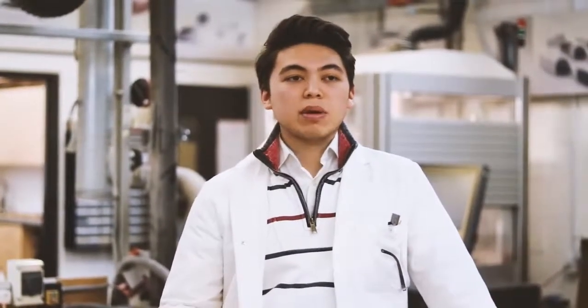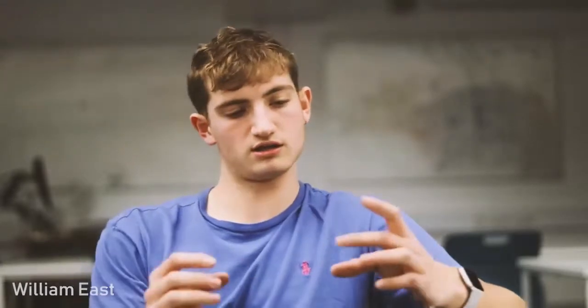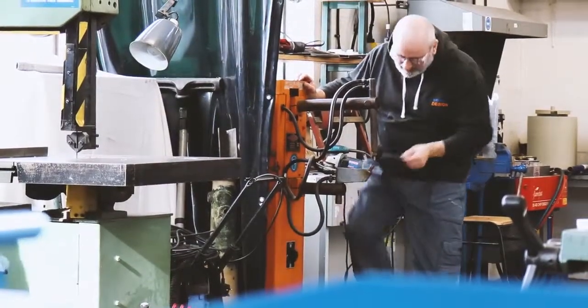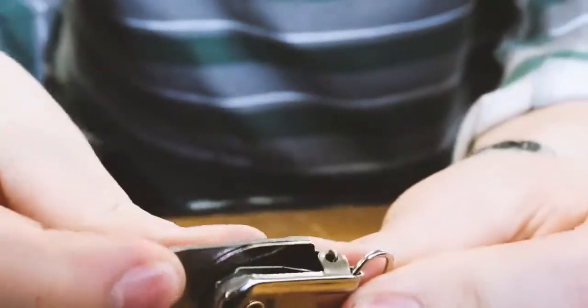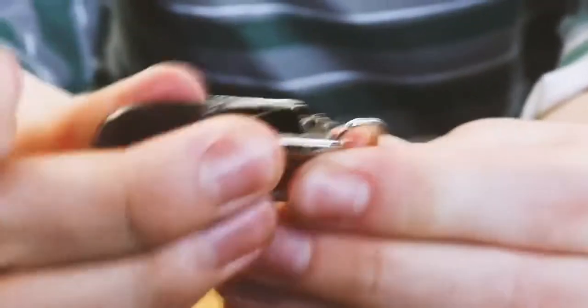For example, he found it tricky to open the clip, which meant we had to find a way of making that easier for him to open. Using Gerald's feedback, we decided to get on with constructing the final product. We decided to spot weld an extra piece of metal onto the original handle of the clip, so that it had more leverage, making it easier for him to open.